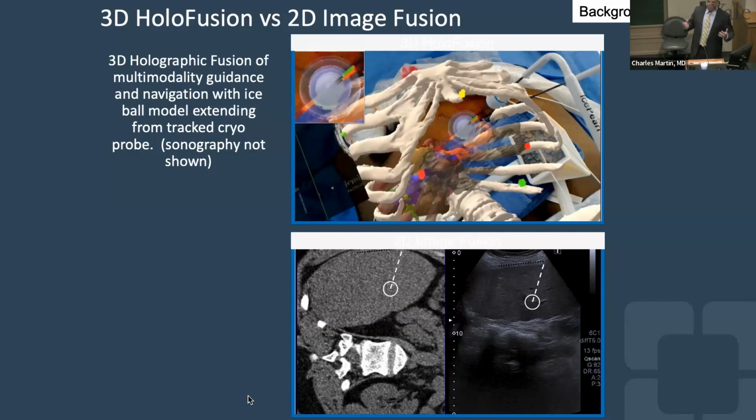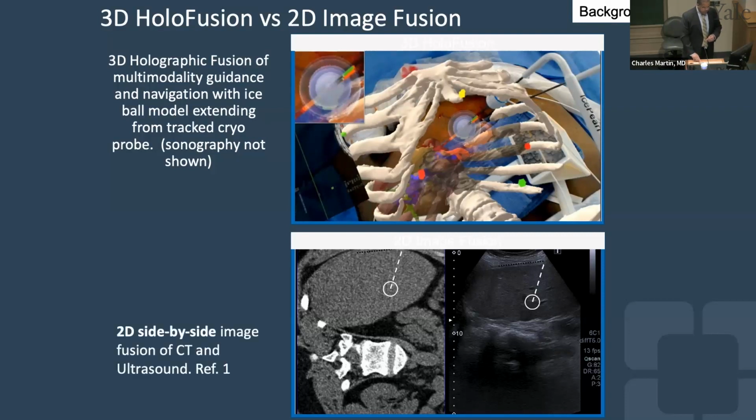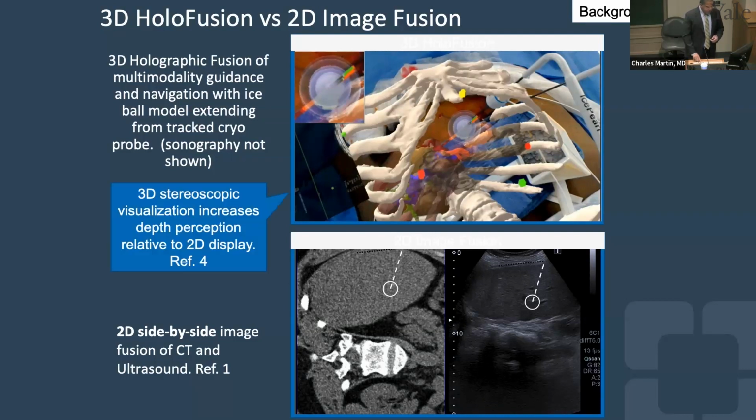One of the other parts that's really helpful is that we can model the kill zone. So before we even put needle to patient, we can tell you how big our target is, the trajectory that we're going to go, how big the ablative area is going to be, and what that's going to look like post-procedure. By doing that, it's helped us effectively navigate, or even sometimes change the trajectory at which we advance different instruments. And this is some of the imaging right here, demonstrating a lot of that.